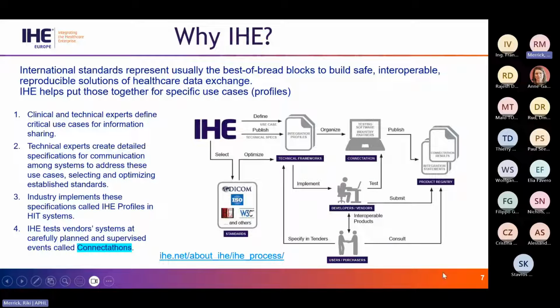It writes the integration profile, and then puts the test cases into the testing software, what Engel just talked about. It's called Gazelle. And then you can test independently, and you can test at Connectathons, and then hopefully systems are much better set up to connect to other systems in the real world as well.